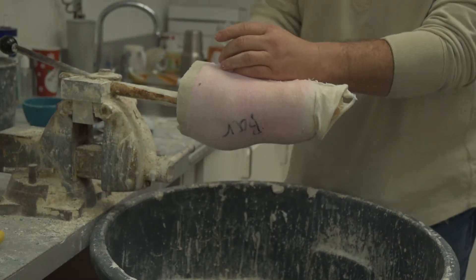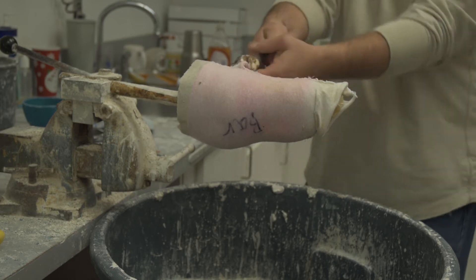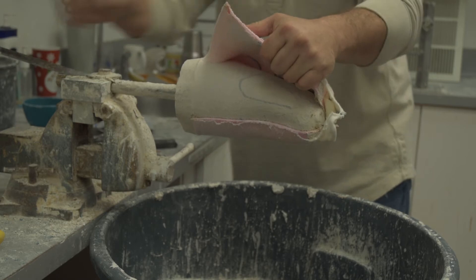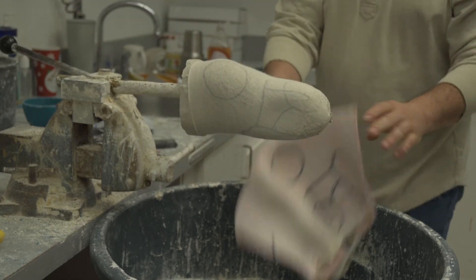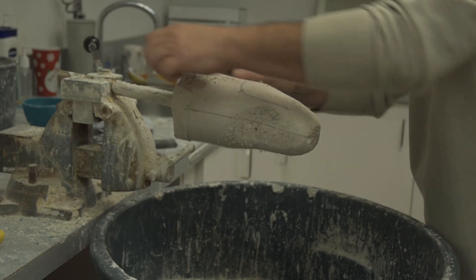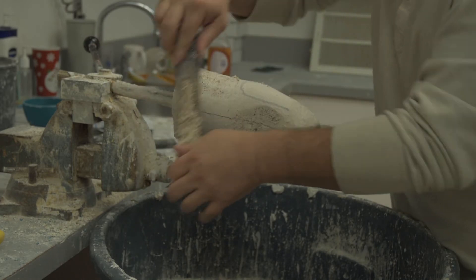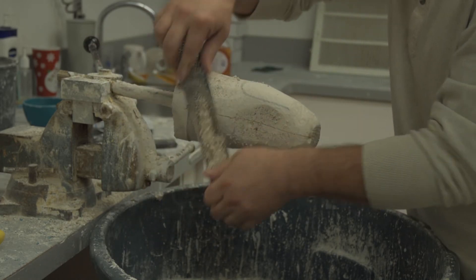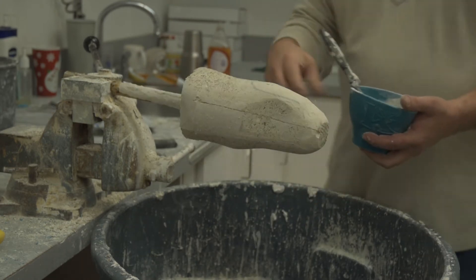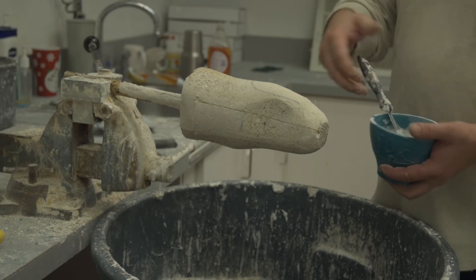Once the plaster hardens, we'll strip off the cast and I'll modify it. I'm just going to smooth out areas and reduce the mold a little bit, and I do buildups over bony prominences.